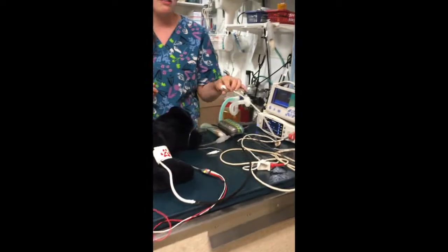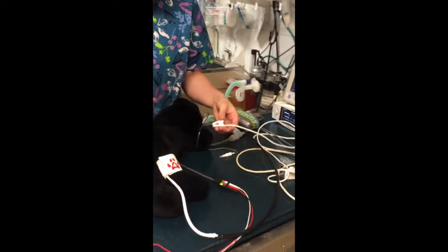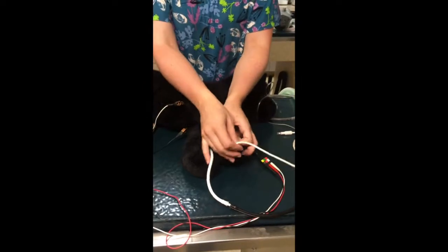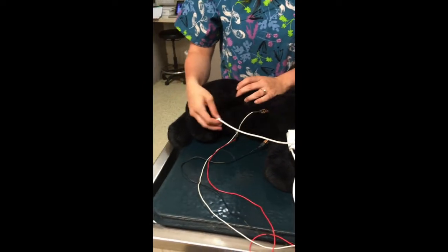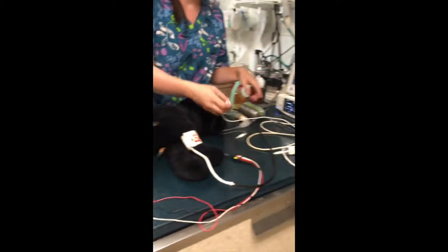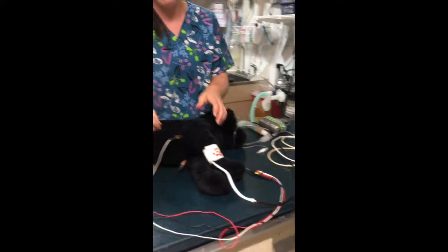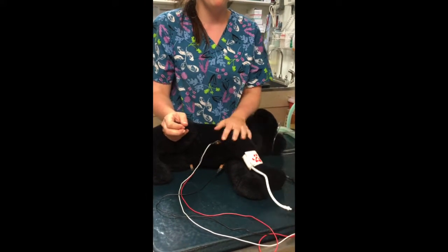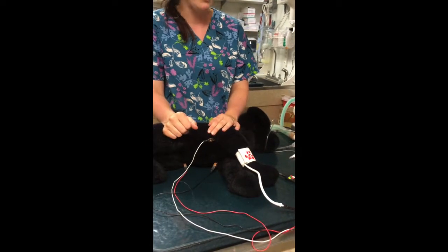Next, I'm going to talk about our SpO2. So our SpO2 monitor can be hooked up to several different places. It can be hooked to the tongue, the ear, the pad on the toe. If it's a male, it can be hooked to the prepuce. If it's a female, it can be hooked to the vulva. So the SpO2 is monitoring the amount of oxygen that is in the blood, and you always want it to measure between 90 and 100%.